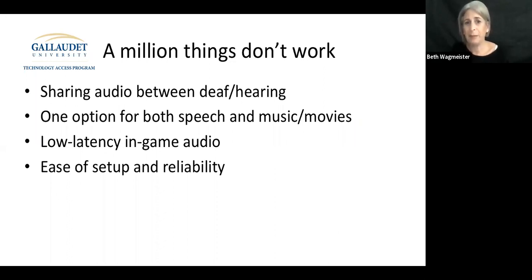So also like video games, right? The audio is delayed with a video game. For example, if you throw something and something falls and it drops, right? You see it drop, but then you hear a few seconds later the drop sound. So it's just very confusing. So video games, it's important. It's hard to connect with the world the same way. With the world also it's just difficult with our different equipment. We wish the CI would be able to connect equally, but it doesn't.